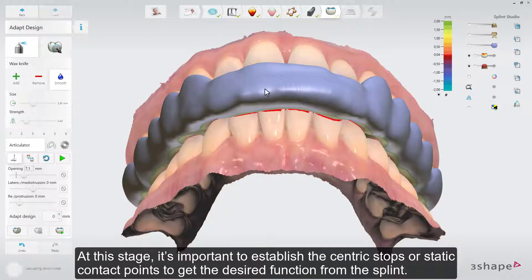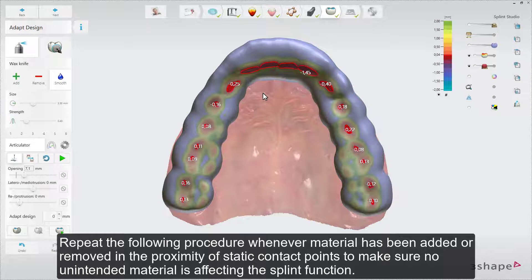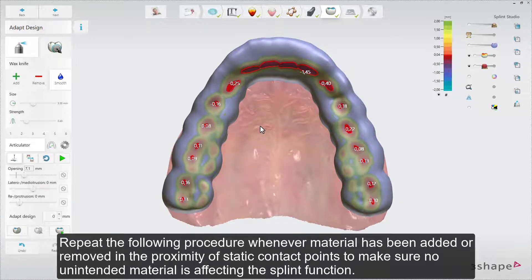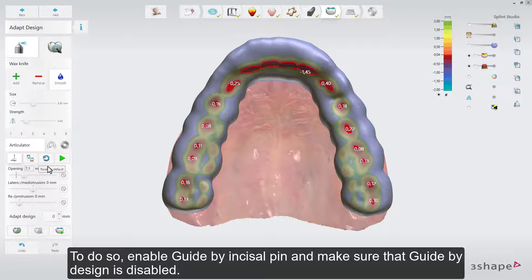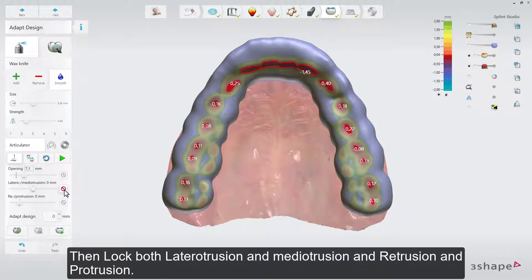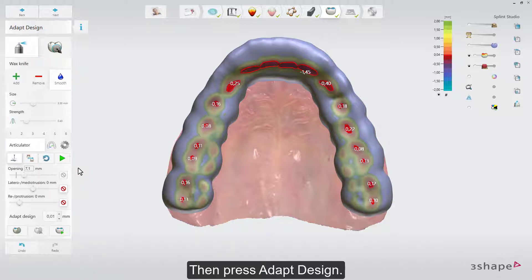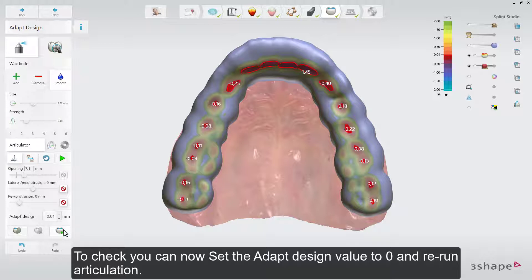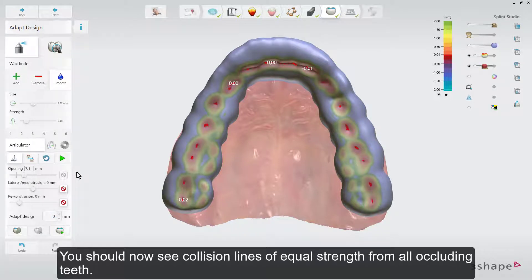At this stage, it is important to establish the centric stops, or static contact points, to get the desired function from the splint. Repeat this procedure whenever material has been added or removed in the proximity of static contact points. To do so, enable Guide by Incisal Pin and make sure that Guide by Design is disabled. Then lock both laterotrusion and mediotrusion, and retrusion and protrusion. Now enter a value of 0.01 mm in the Adapt Design field and run Articulation. Then press Adapt Design. To check, set the Adapt Design value to 0 and rerun Articulation — you should now see collision lines of equal strength from all occluding teeth.